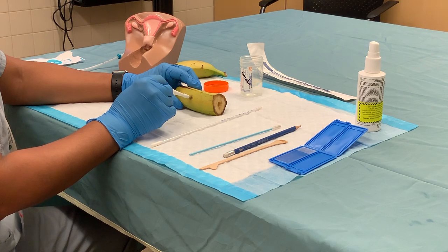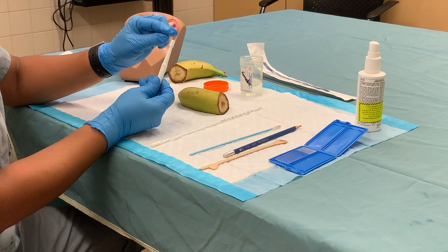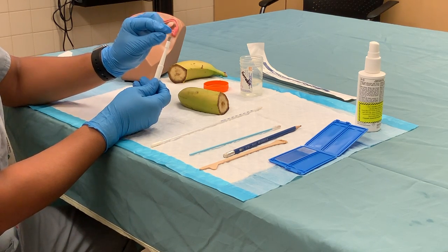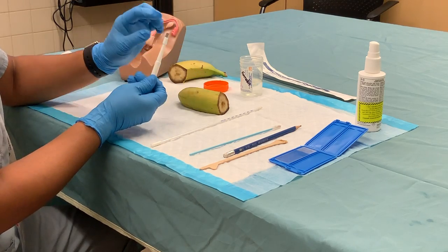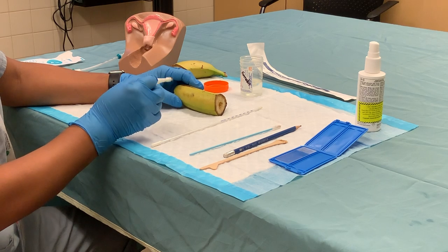Apply it directly and firmly onto the vulvar skin. You are not going to embed the entire metal portion into the vulvar skin, as that would leave a very large defect, cause bleeding, and be very uncomfortable for the patient.